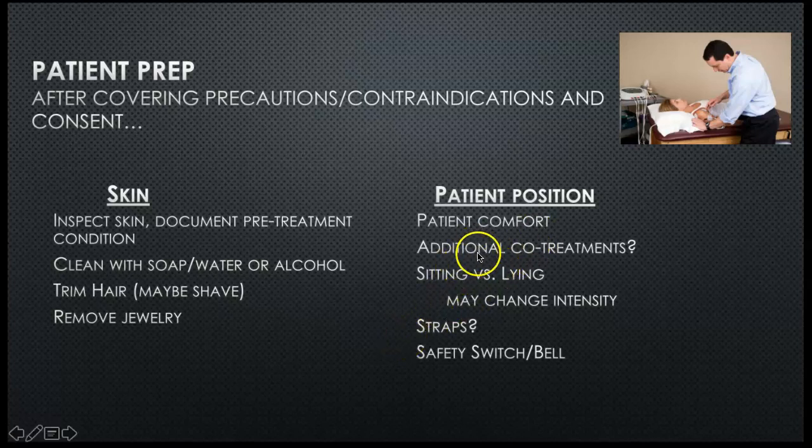You might be applying something else at the same time, such as ice or a hot pack. Just beware if they're sitting or lying on something. If you set up the e-stim on their low back, and then they lay down on it, you can really increase the intensity. So if you set it up while they're sitting and you turn it on and they go, yeah, that feels good, and then when they lay down, the weight of their body on the electrodes will increase the intensity. So I would suggest always putting them in the full position they're going to be in and then start turning on the e-stim.